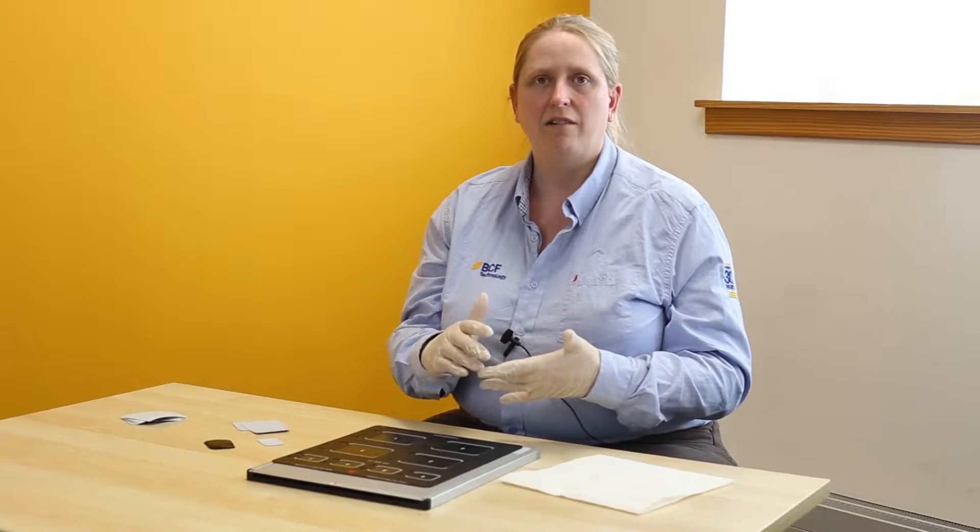You will notice during the video I'm wearing gloves and this is because sweat, saliva, hand gel, alcohol gels and different things are all corrosive to the screens. So in order to protect the screens we always recommend you wear gloves.